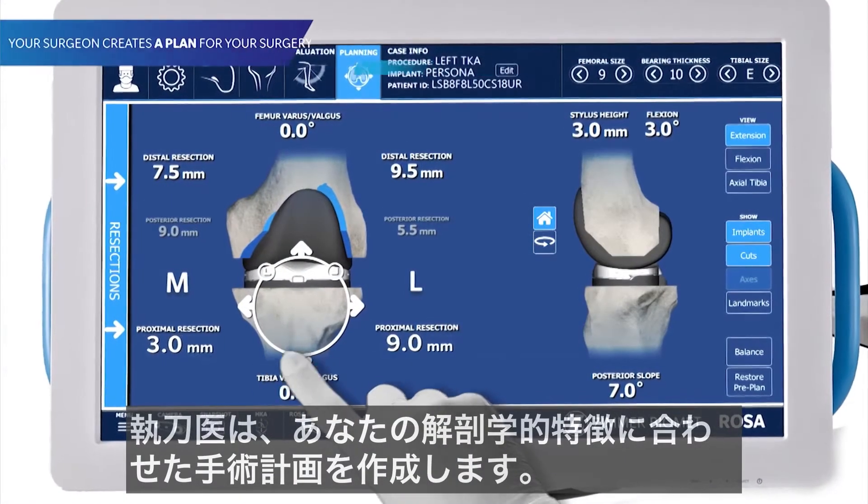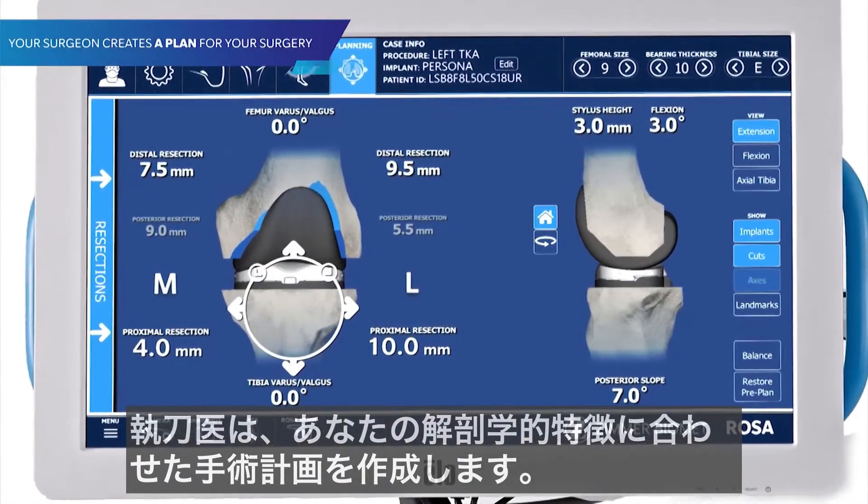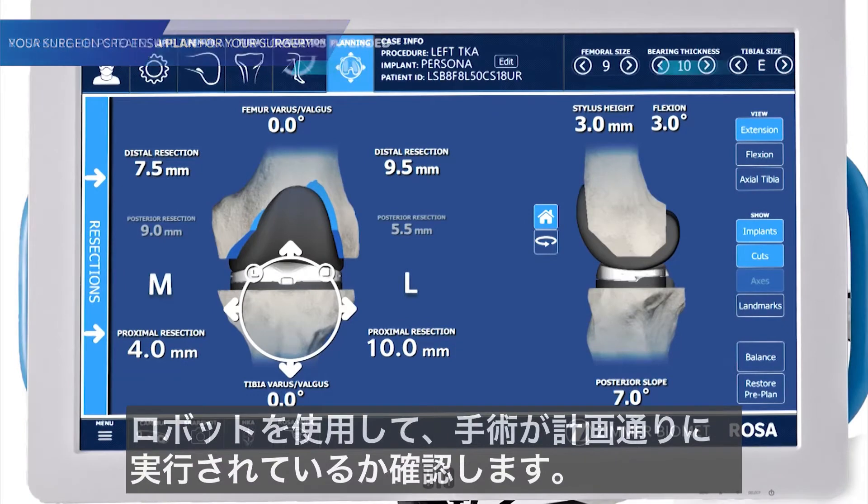Your surgeon creates a plan for your surgery based on your unique anatomy. The robot helps to ensure the plan is executed as intended.